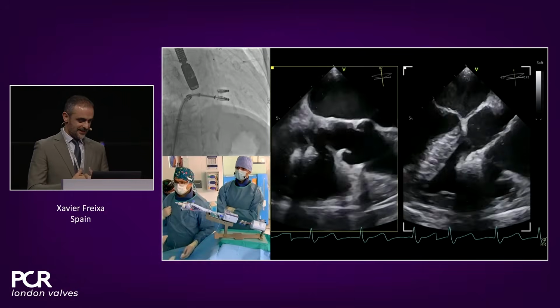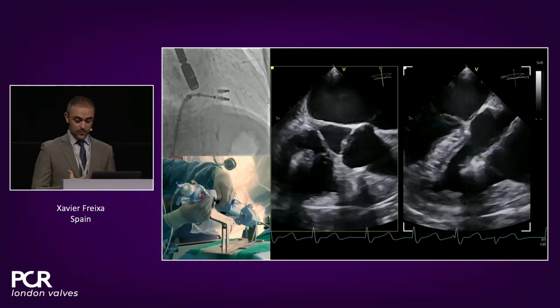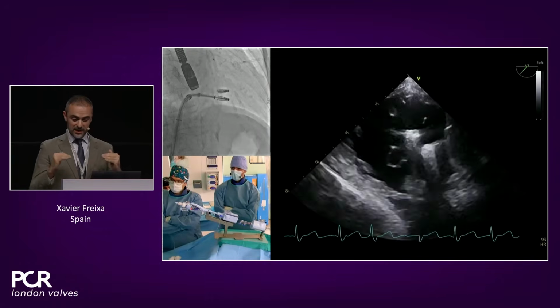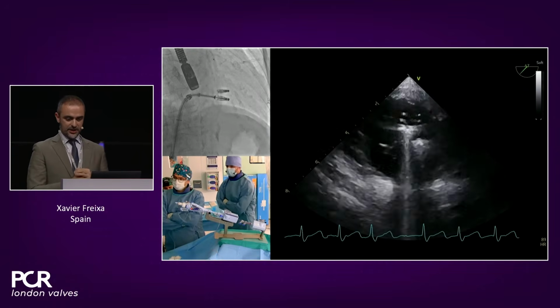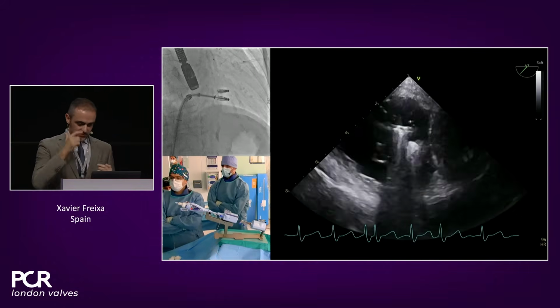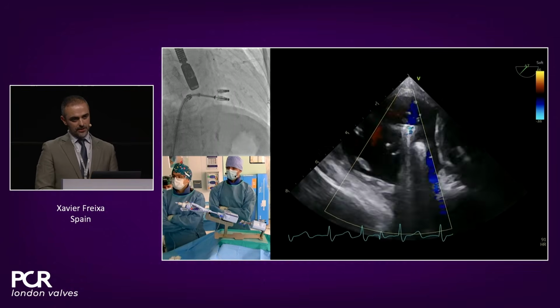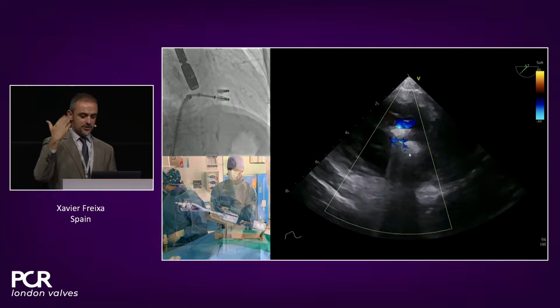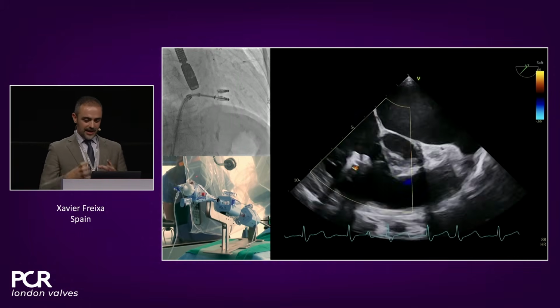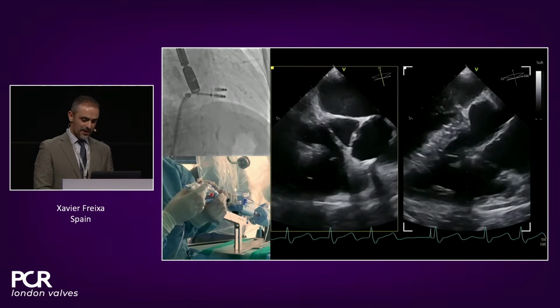And again, it's just our job to evaluate if that's what we're looking for. That's enough. That's not enough. So you can see that both leaflets are in, clearly in, especially the posterior. But maybe the septal, I would say that it's not just the tip, but it's maybe not the amount of leaflet that we wanted. Again, we anticipate the future of this lady with all this pressure, with all this gap. And really, we would like to have more tissue inside the arm of the clip.